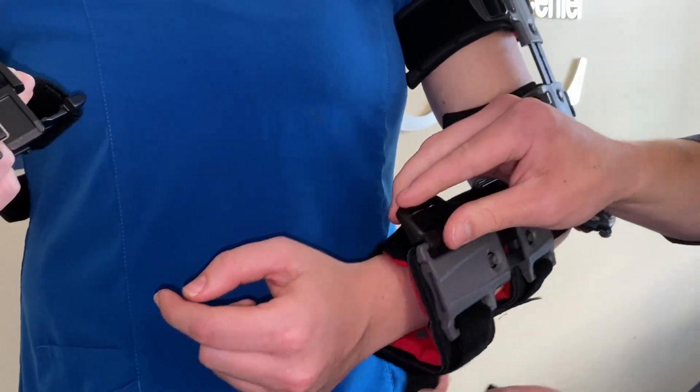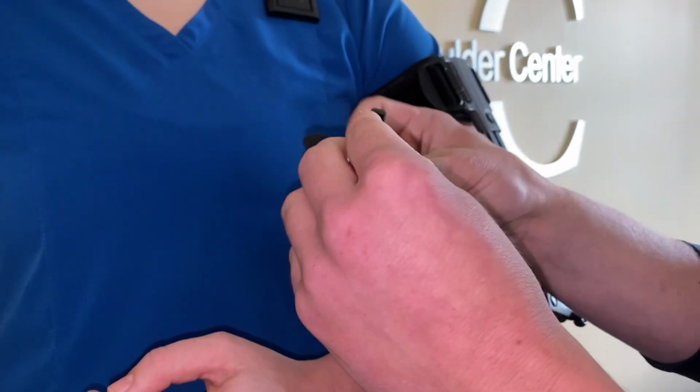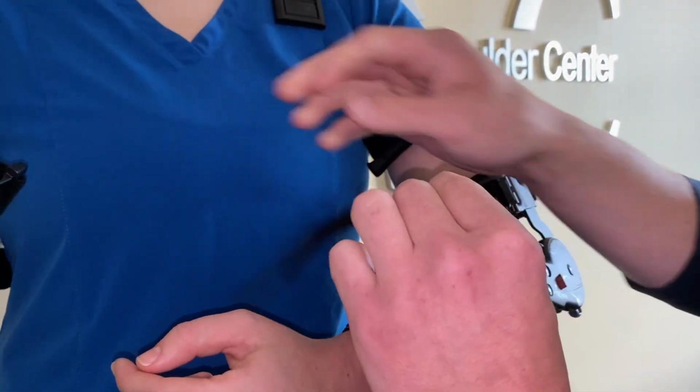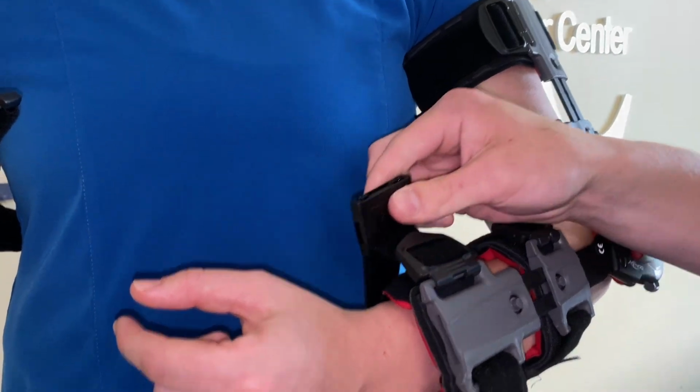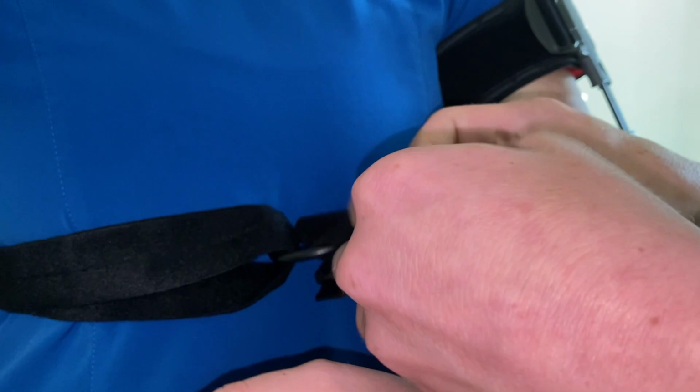You may have noticed that there is a sling component to your brace as well. Typically, this is not utilized. However, in order to attach the sling, you must feed the Velcro tag from the cuff closest to your wrist through the clip on the sling and fasten the Velcro.